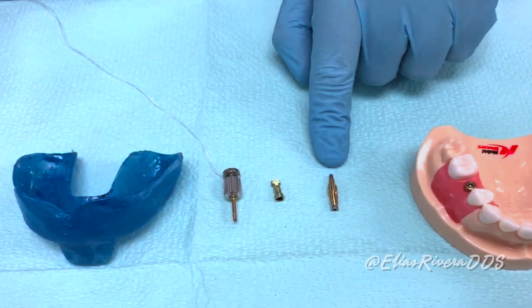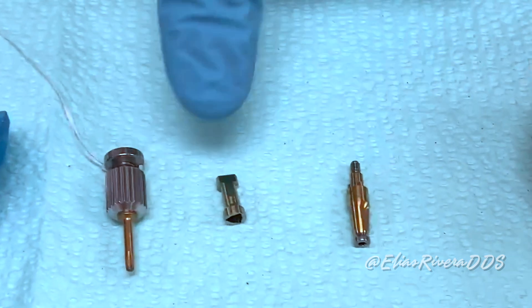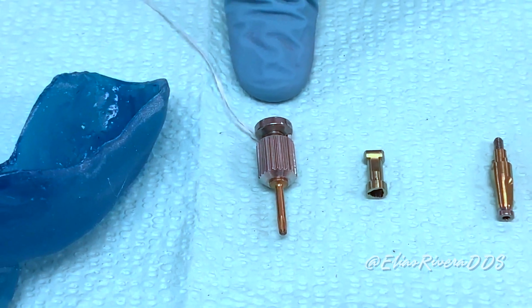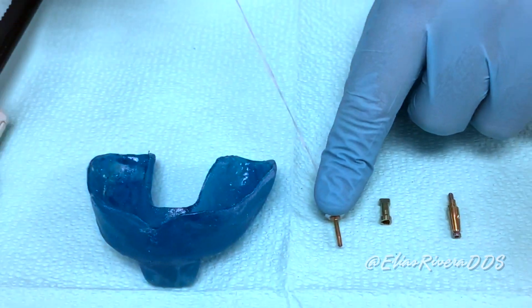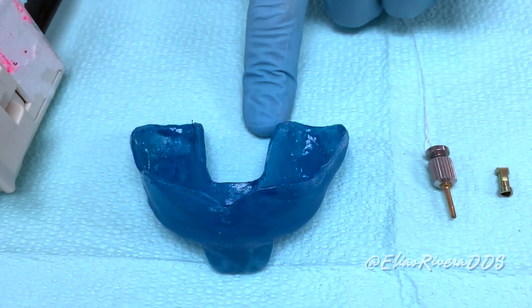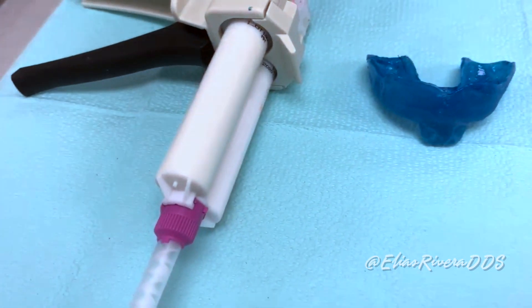We also have our implant restorative components ordered with our faculty: the closed-tray transfer impression coping, implant analog or replica, screwdriver with attached dental floss to prevent aspiration, and a custom tray to which we have already applied the adhesive — PVS — and the impression material.